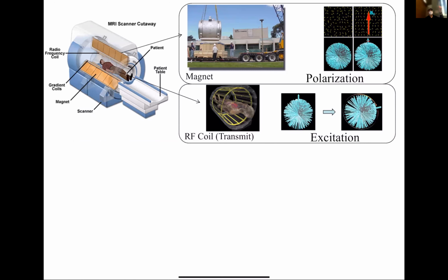Whereas if it's just here, it's a magnetic field and we could detect it, but it's not time-varying, so it's a lot harder to detect. Anytime you have a time-varying magnetic field, you can just put a wire out here and listen and see what that time-varying magnetic field is, right? Through Faraday's law, any dB/dt is going to cause some electric field in some pickup coil. So that's the basic principle of why we want to excite, so we can have this time-varying magnetic field.